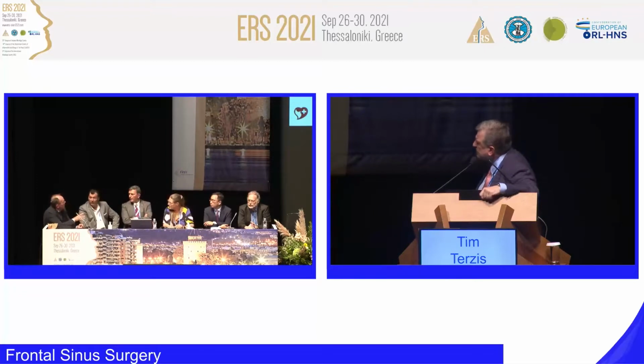That's a very good plan by Wytske. So I would be interested, I mean, the case is fantastic because it's a bit away from a standard case, so a little bit more tricky. And the danger is really the medial orbital wall, which is protruding. It's looking like somebody who came to the Oktoberfest, had too much beer and got some in the face.